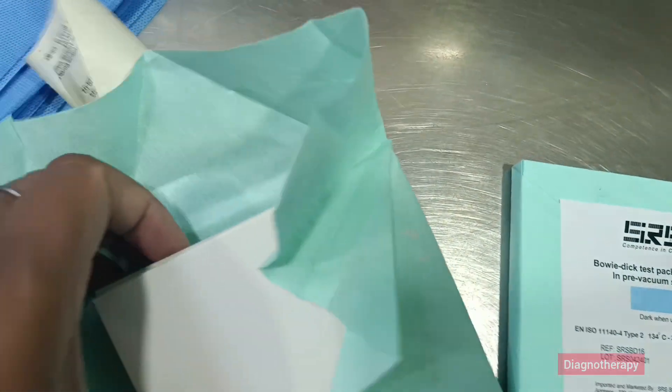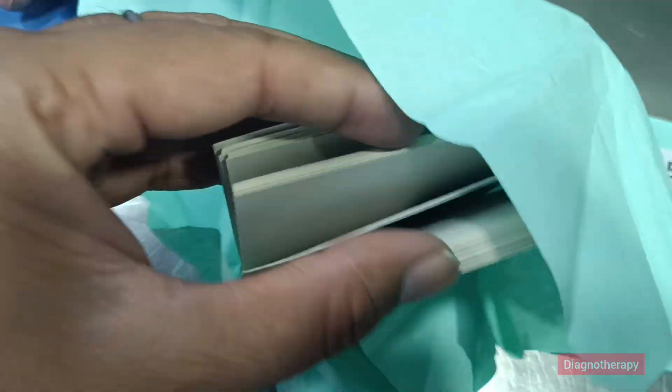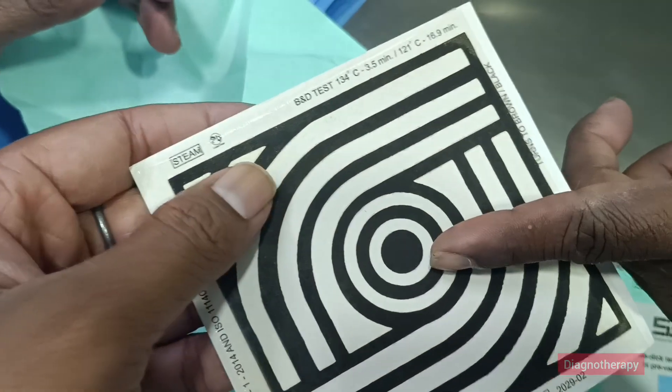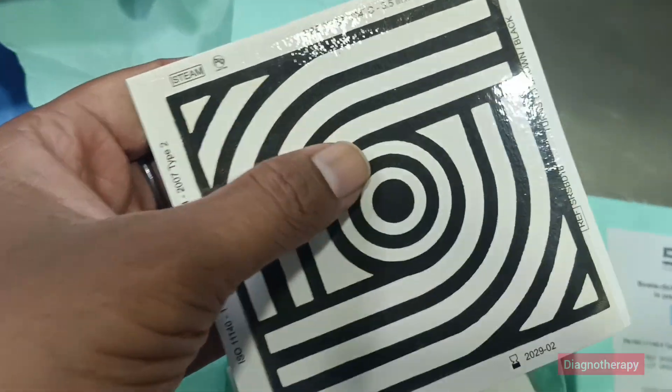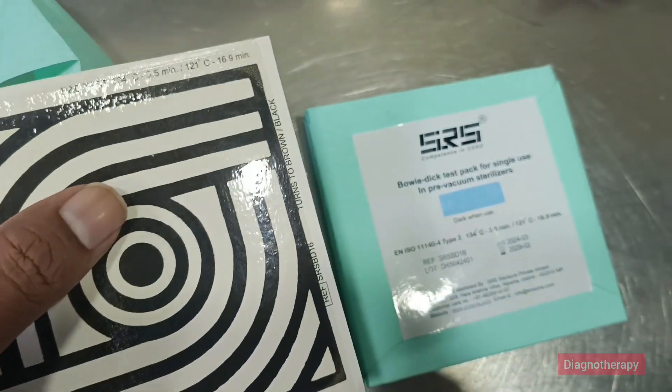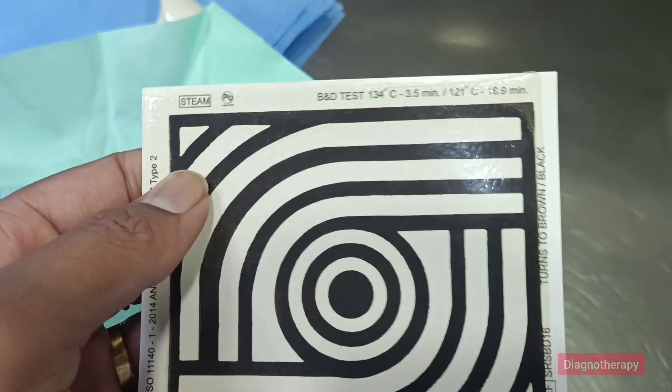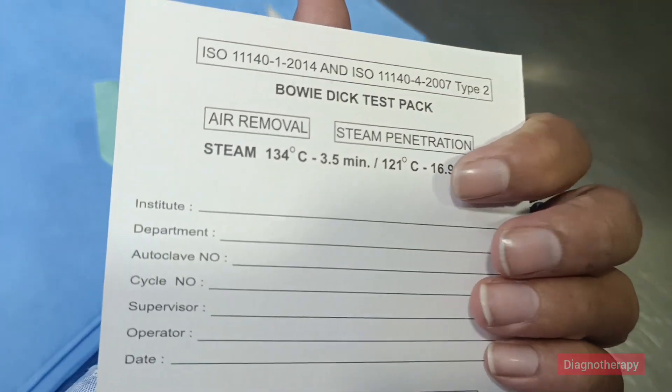One of the samples we have received from the company as a demo piece — you can see this is black, so this is the sterile one. After sterilization it turns black, and inside the packet you can see the color change.